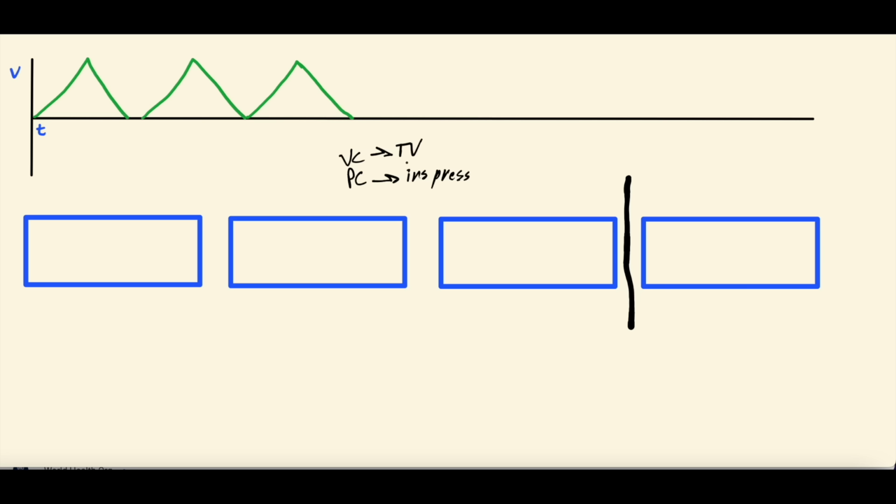So in volume control, you're controlling the tidal volume the patient is getting with each breath, or the cc's of oxygen that the ventilator is pushing into the lungs with each breath. That's the tidal volume. But what you're not controlling, the uncontrolled variable that results from this, is the pressure, the inspiratory pressure, the peak pressure in this case.